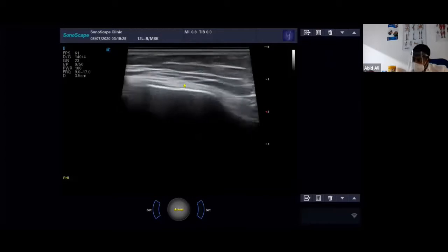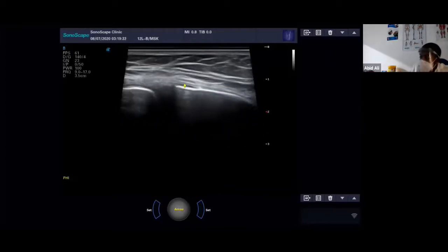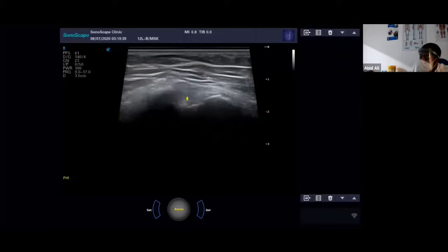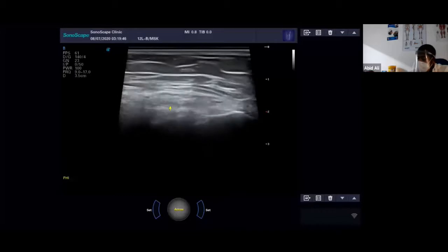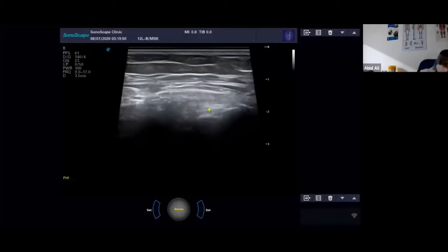If you come down, just while we're on the medial side, if you come down to the joint space, go slightly down until you see this dip. This is actually where the semimembranosus inserts. So you can see the semimembranosus here nicely.